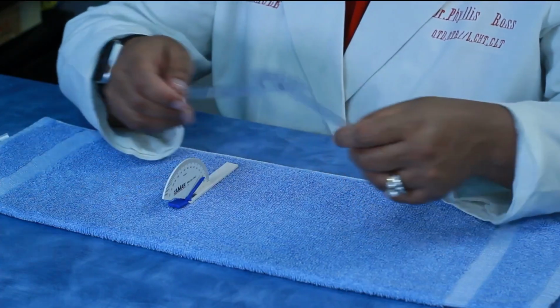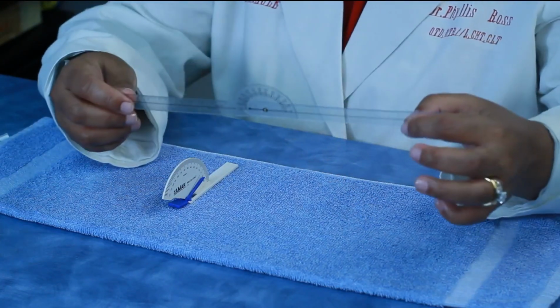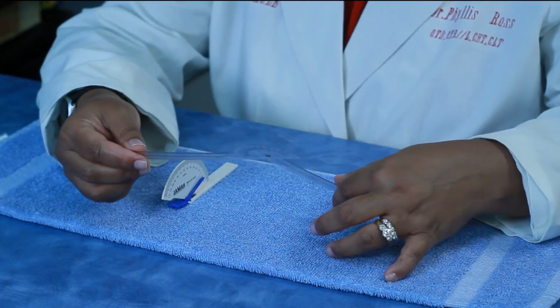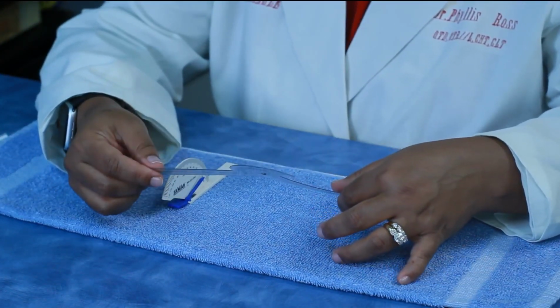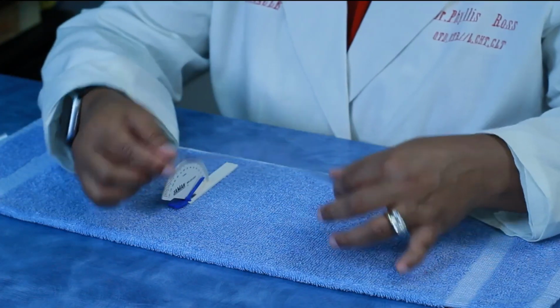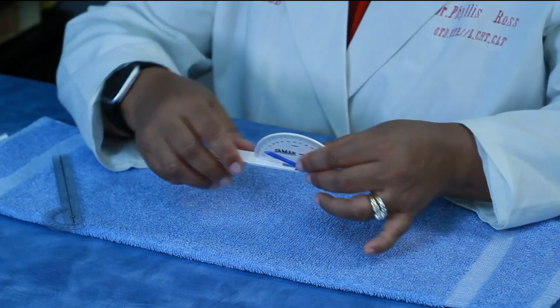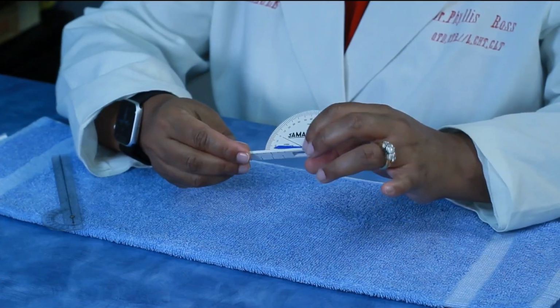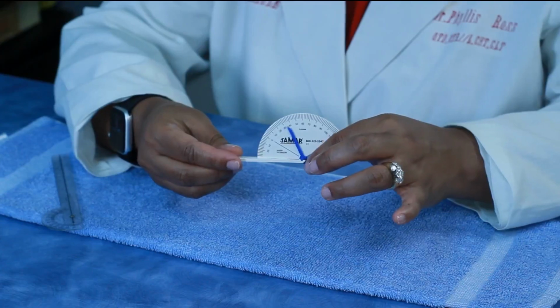So essentially you're going to be using one goniometer that you are very familiar with, the half moon. We will use this one in only one of our measurements, and that will be for the CMC joint measurement of the thumb. And then of course this is another half moon goniometer. This is your fulcrum on this particular device.